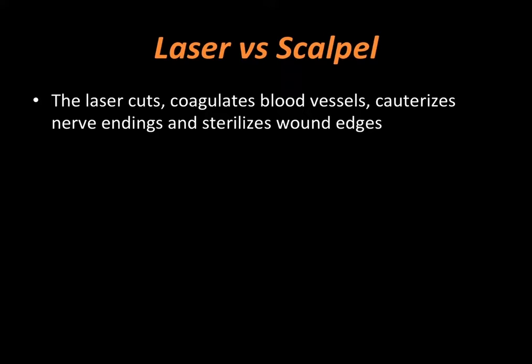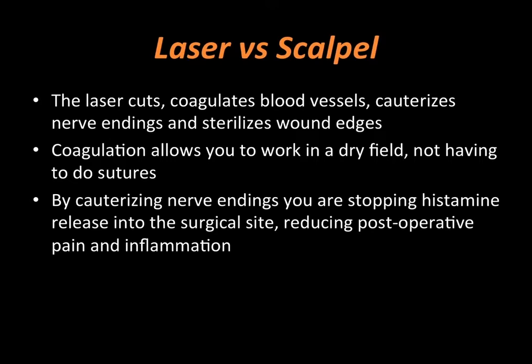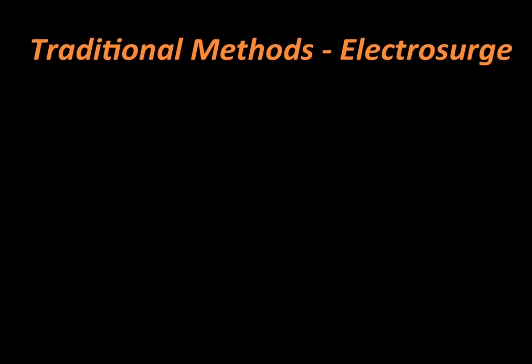The laser cuts, coagulates blood vessels, cauterizes nerve endings, and sterilizes wound edges. The coagulation allows us to work in a dry field, not having to do sutures. And by cauterizing nerve endings, we're stopping histamine release into the surgical site, reducing the postoperative pain and inflammation. And we're sterilizing the wound edges, which eliminates the chance of infection.